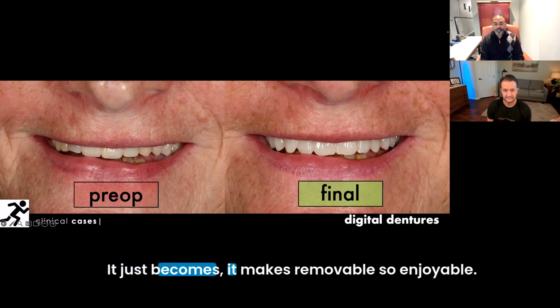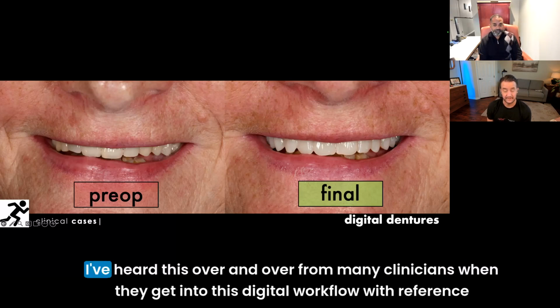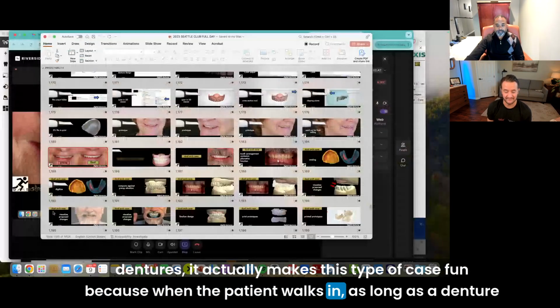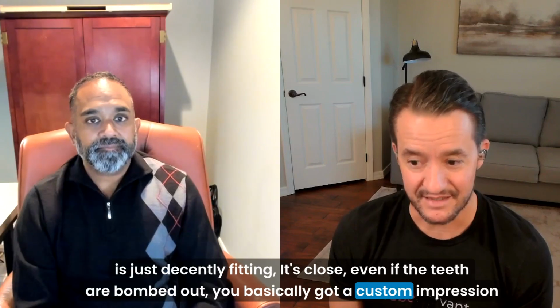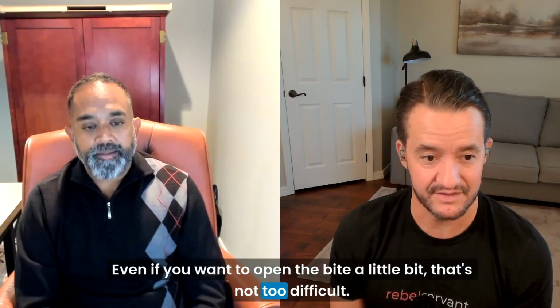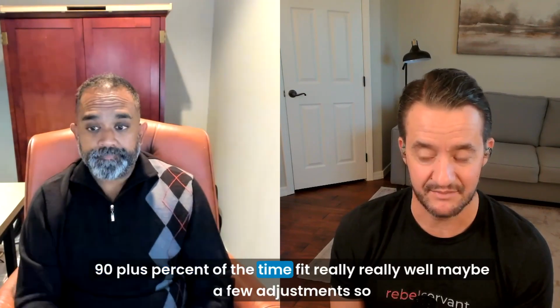It just makes removable so enjoyable, and I can't stress that enough, that anybody can do this. I've heard this over and over from many clinicians when they get into this digital workflow with reference dentures. It actually makes this type of case fun, because when the patient walks in, as long as a denture is just decently fitting, it's close. Even if the teeth are bombed out, you basically got a custom impression tray to start with. You're going to have a good bite. Even if you want to open the bite a little bit, that's not too difficult. And you can get to a prototype that's going to fit really, really well 90+% of the time.